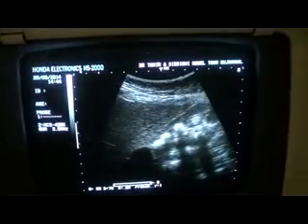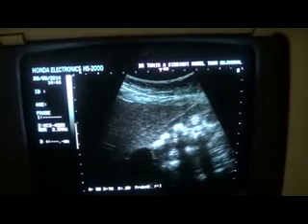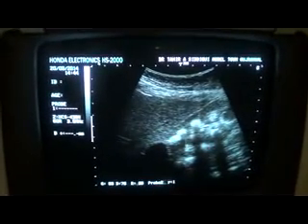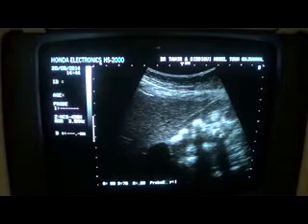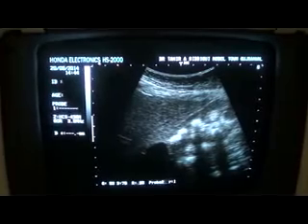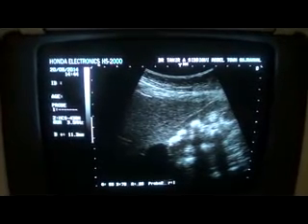Let's get a better view. This is a better view. See, these echogenic areas are not in the central sinus echocomplex. Rather, they are in the region of the anterior medulla and the region of the posterior medulla. This is the posterior medulla, posterior parenchyma, and they are shadowing, though in typical cases we will not see shadowing.